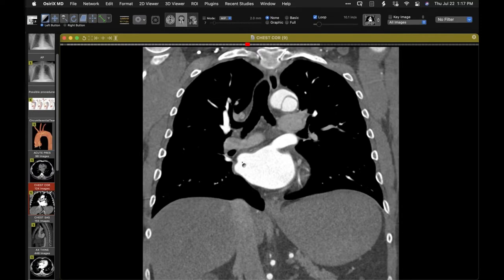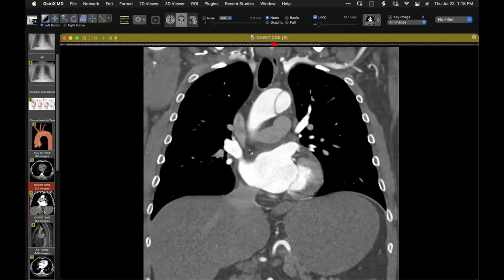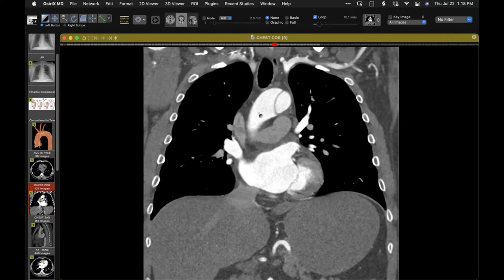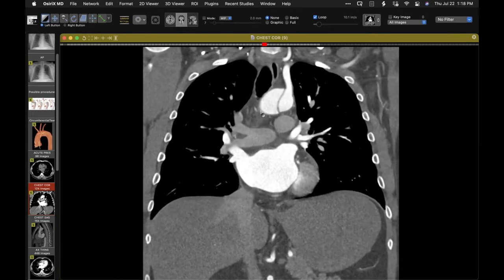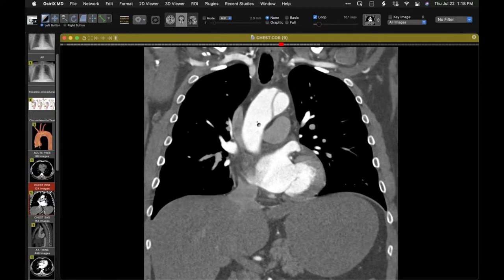This one doesn't show what you sometimes might see, which is a distal intimo-intimal intussusception, where the intimo-medial flap itself, like spaghetti, will go into a brachiocephalic artery or so. That can happen, but it's not present in this particular case. But I have shown some of that before, where the distal intimo-intimal intussusception may result in the flap entering into or narrowing the brachiocephalic vessels, but they will deal with that at the time of surgery.